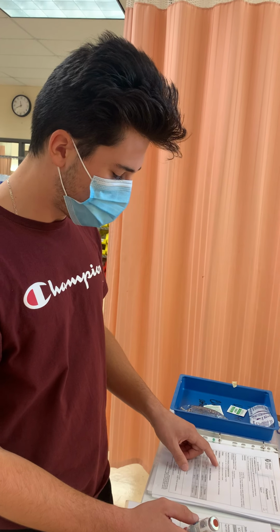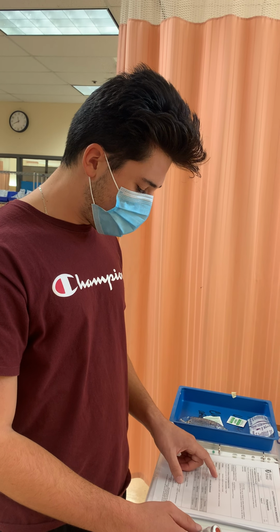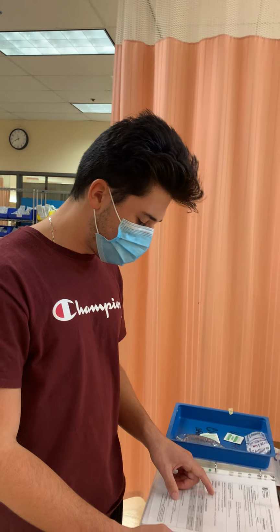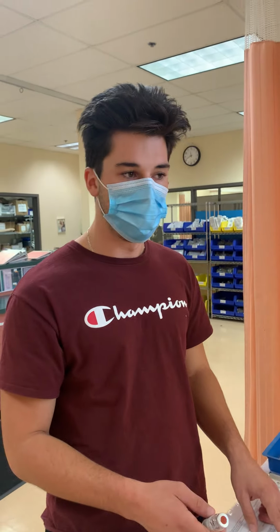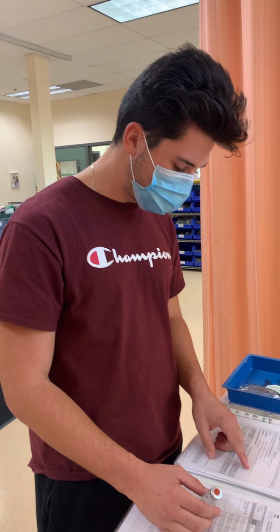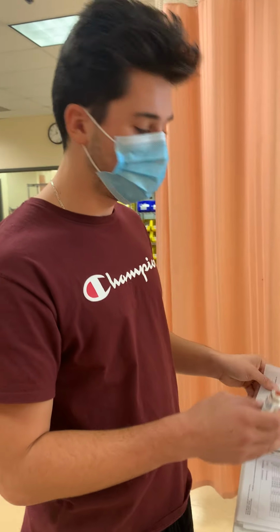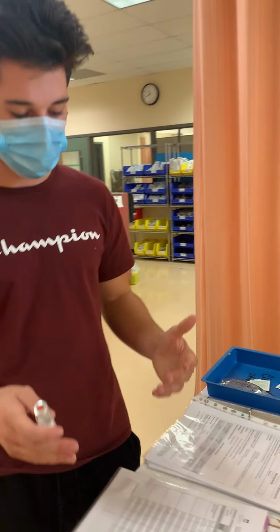I'm going to be choosing 50 mLs of normal saline as they may be on fluid restrictions in this case. I'm going to administer over 30 minutes instead of 15 as it's the patient's first time receiving the medication, so I want to infuse it a little slower. I've also seen that it's compatible with the normal saline primary, and that some potential hazards to watch out for are diarrhea and headaches, so I'm going to note those.